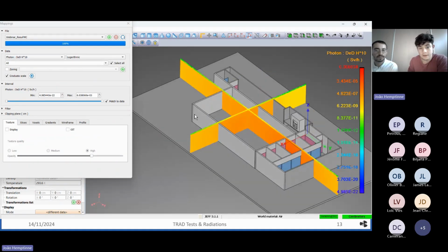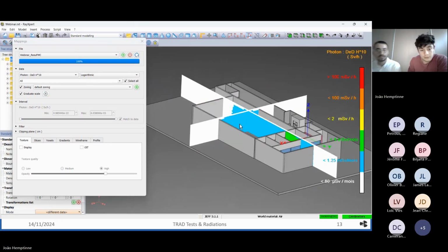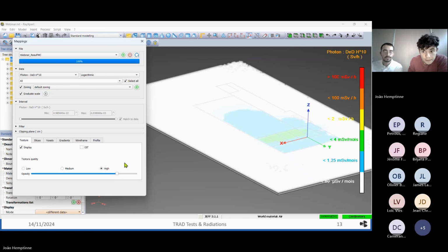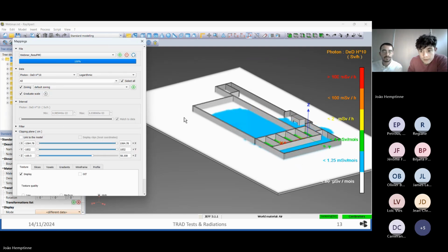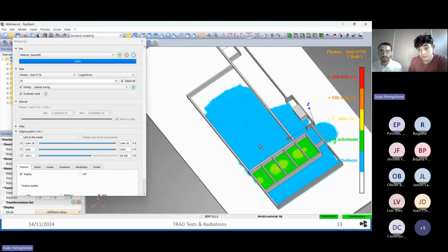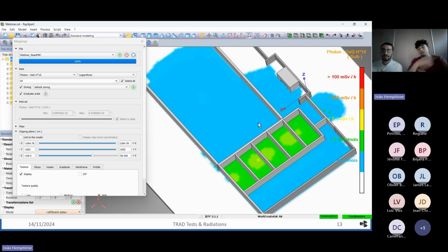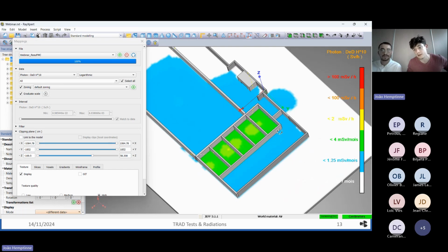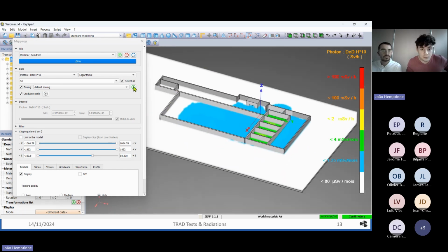And as Joao said, you can also set zoning. Here, as Joao said just before, it's the French zoning. Maybe in English it's not exactly the same values on the right, but if you want to set your own zoning, your personal zoning, it's totally possible.